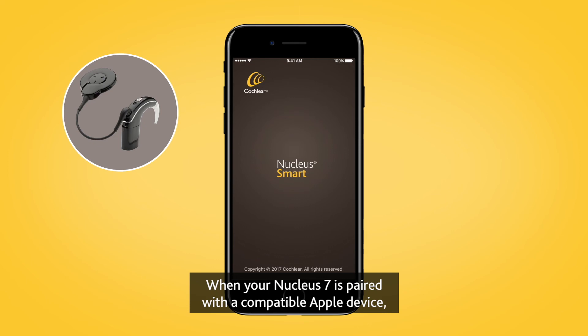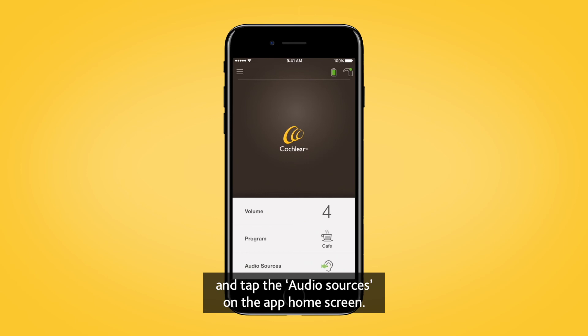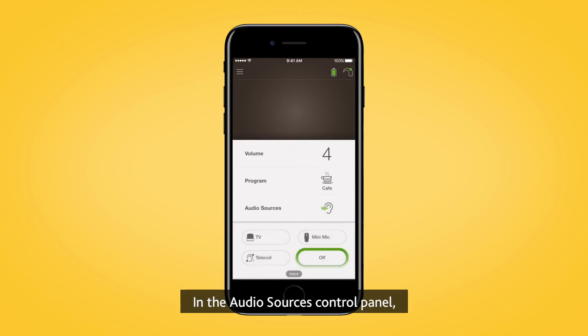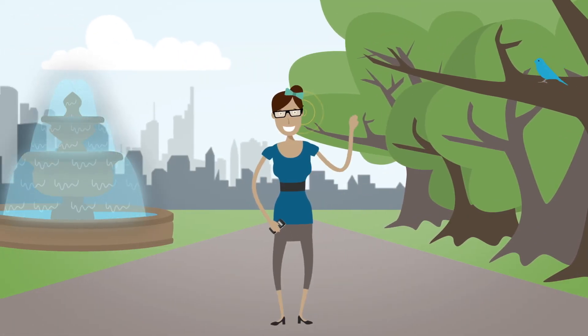When your Nucleus 7 is paired with a compatible Apple device, you can also control streamed audio using the Nucleus smart app. Open the app and tap the audio sources on the app home screen. In the audio sources control panel, tap the icon for the audio source you want to use. Tap off to stop streaming audio and return to the previous program.